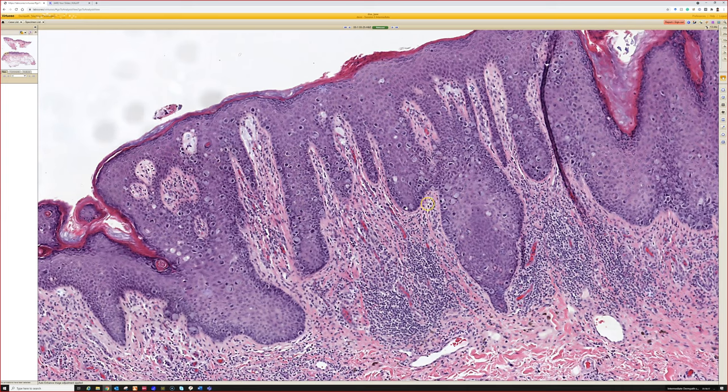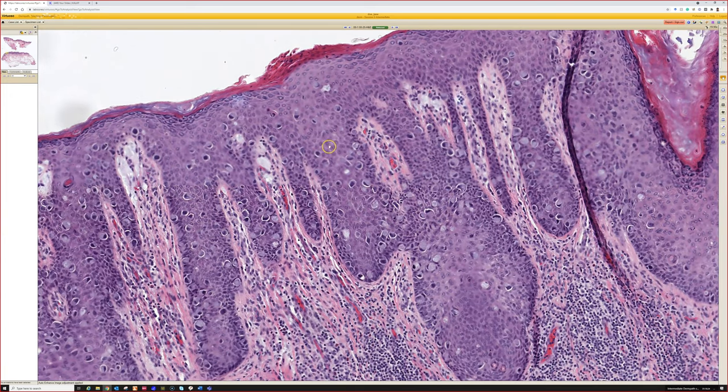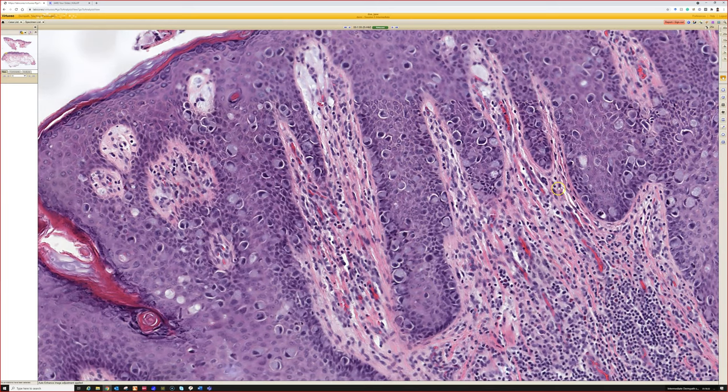Yeah, this is Paget's disease. This was from the vulva, I think, so extramammary Paget's. And here you can see all these atypical cells with Pagetoid spread. And you can obviously see on H&E the blue mucin, the mucus that the cells are producing, and it's giving the cells a signet ring appearance.